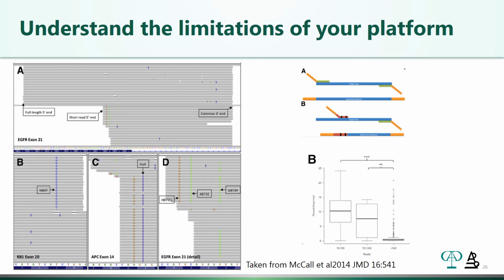mutation over here. Anyway, so you have this erroneous binding of the primer in a different place in EGFR, but because it isn't binding with 100% overlap, it actually generates a mutation because of the sequence of the primer, and that mutation is then seen only in that specific amplicon.